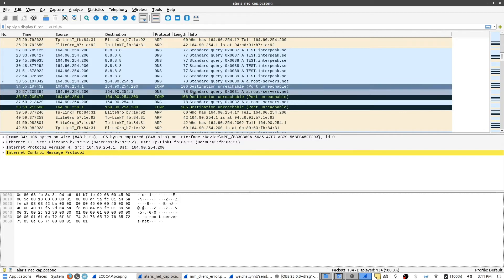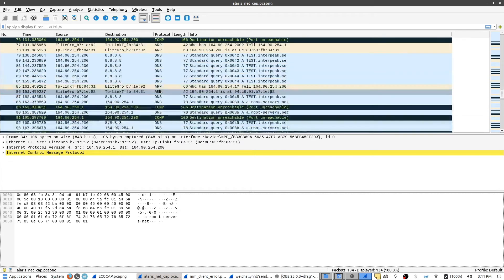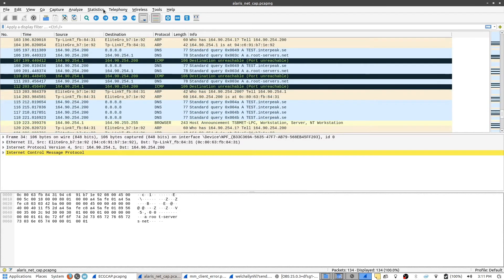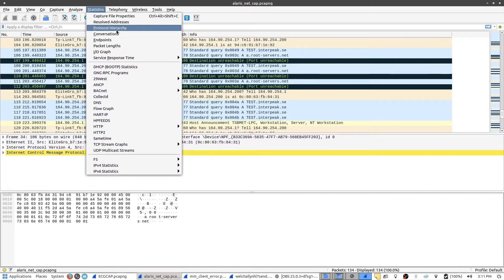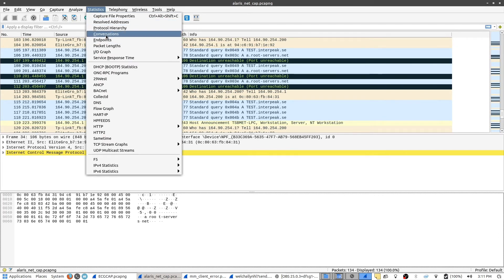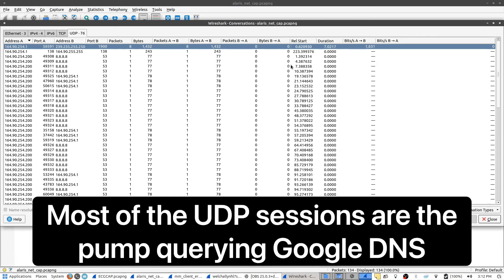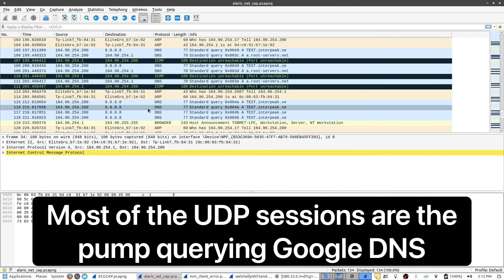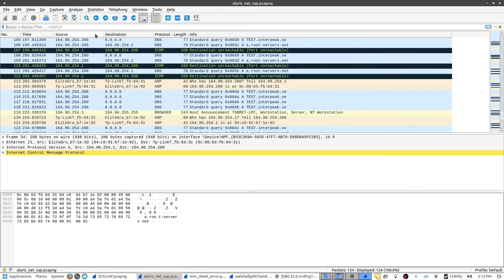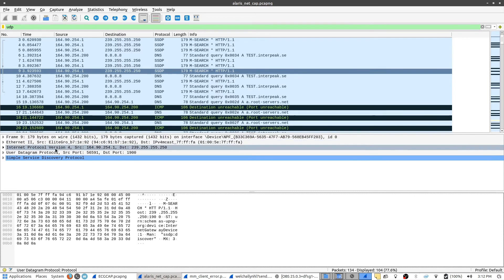You'll have some that come back with ICMP port unreachable, and you'll never see it initiate any kind of TCP or UDP sessions. If I go to statistics and conversations, you can see the TCP and UDP tabs here — there are no TCP sessions open at all. There is a UDP stream, but it never does anything successful with that. SSDP is the only other protocol besides DNS that's currently in use, and it's never actually able to reach the outside internet.